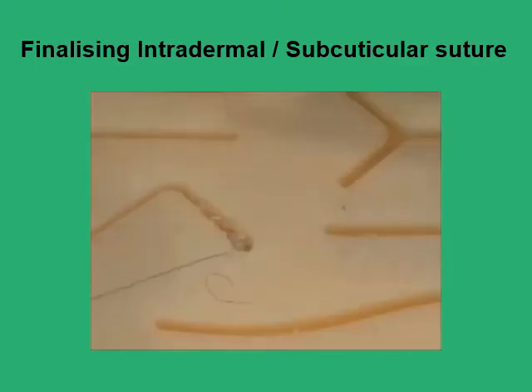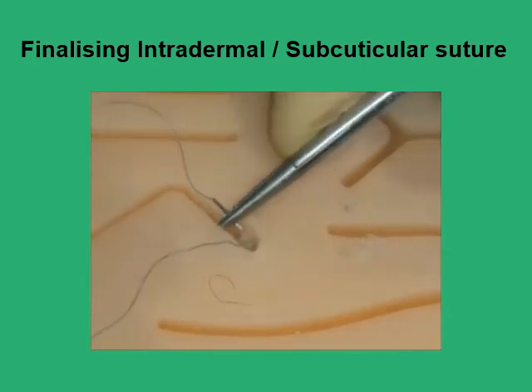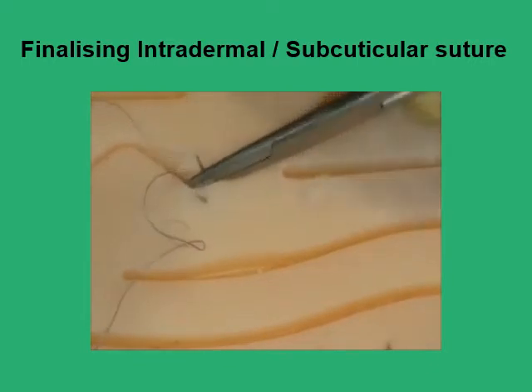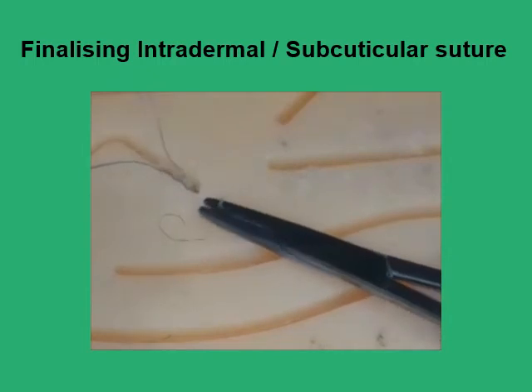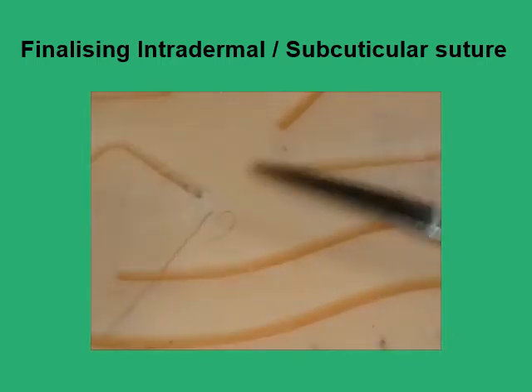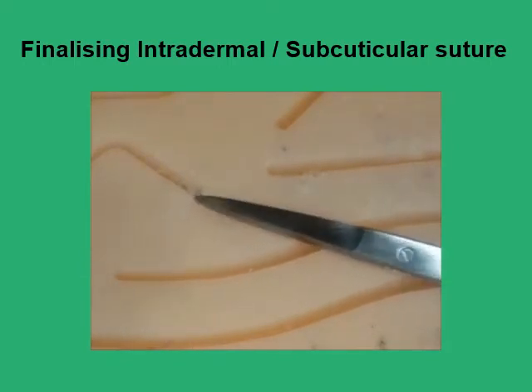Once you have achieved this, retrieve the needle, go below the knot, come up to the surface beyond the apex of the wound, pull on the thread, and the knot is now buried in the subcutaneous tissue. You then cut flush with the skin surface.